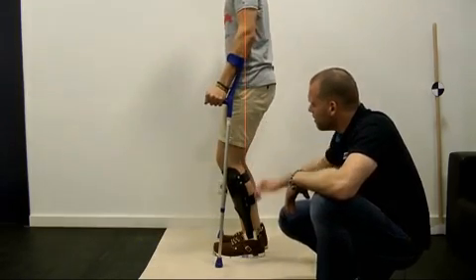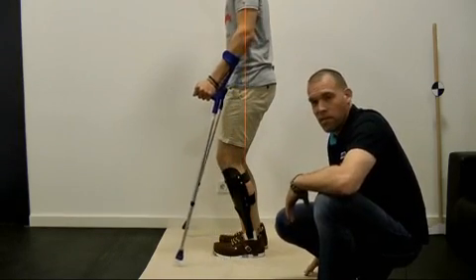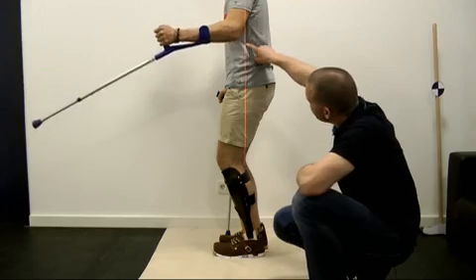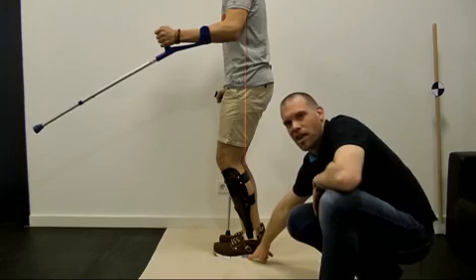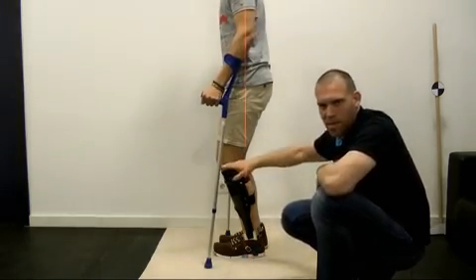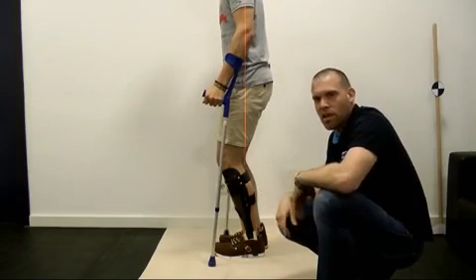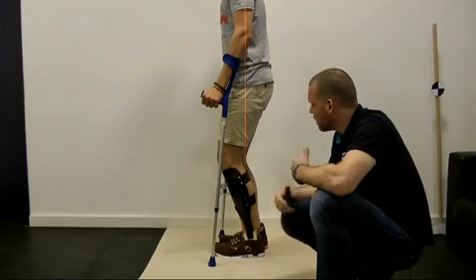I would definitely say yes, because the plumb line from the body center of gravity is still falling on the previously marked place on his foot. Even if the knee axis is not in the right position in relation to the plumb line of the center of gravity, it's still a stable standing position, and certainly an alternative way to find a stable posture whilst standing. We would say the necessary balance is provided.